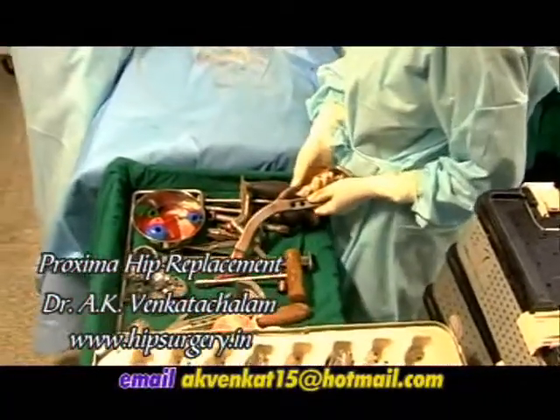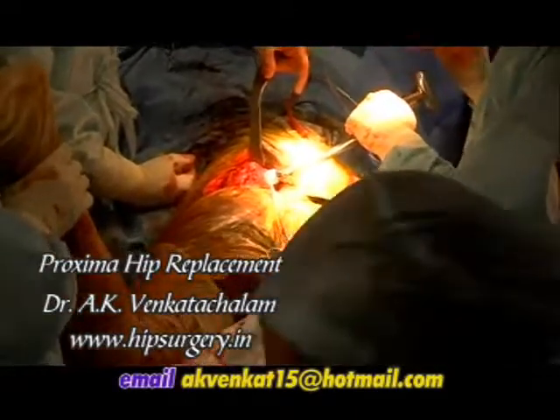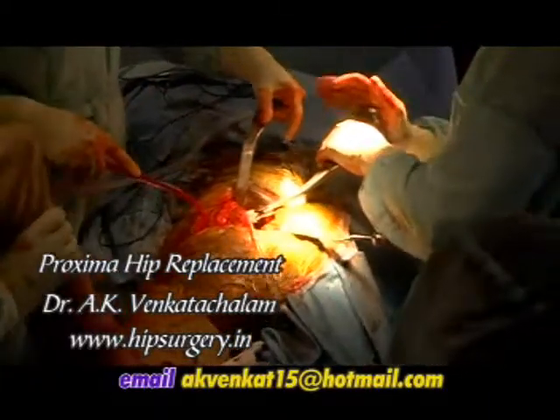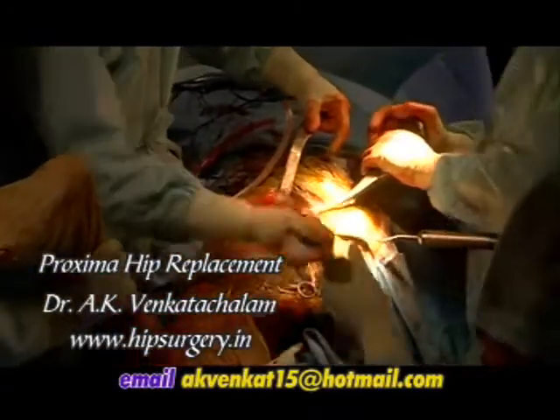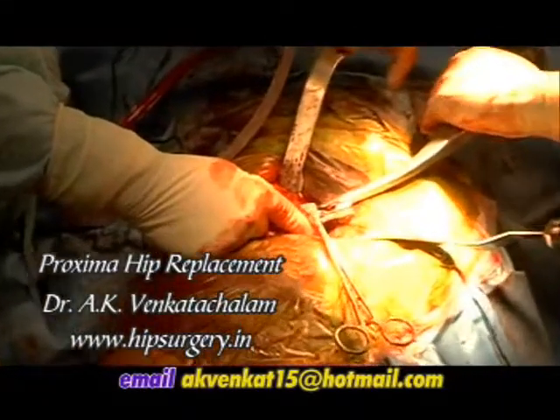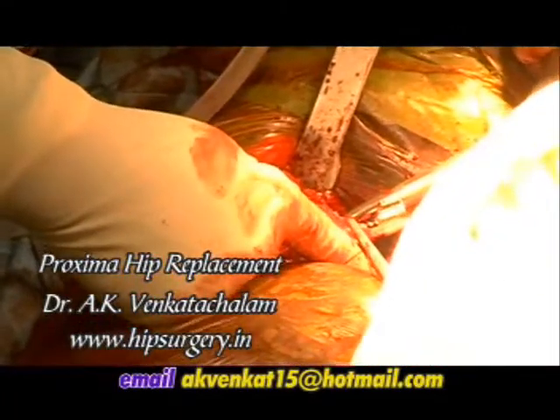The definitive DePuy Proxima implant is introduced into the broach envelope using the same round-the-corner technique using the stem inserter impactor. The implant must follow the path of the last broach. The final implant should be seated as far into the broach envelope as possible without undue force. The implant must be in neutral alignment before final impaction. Impaction with the insertor instrument is complete when the implant cannot progress any further and the poro-coat is level with the neck cut.